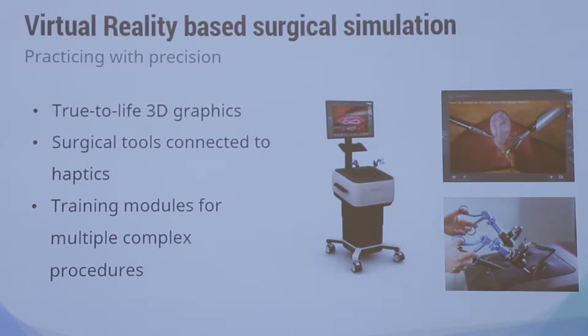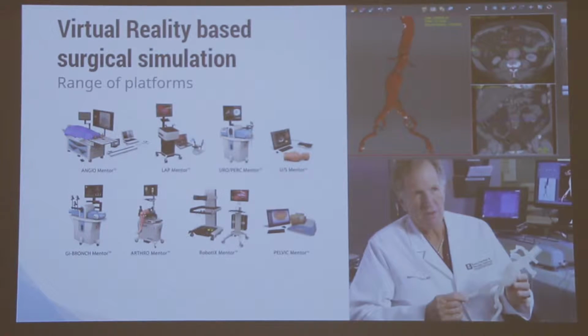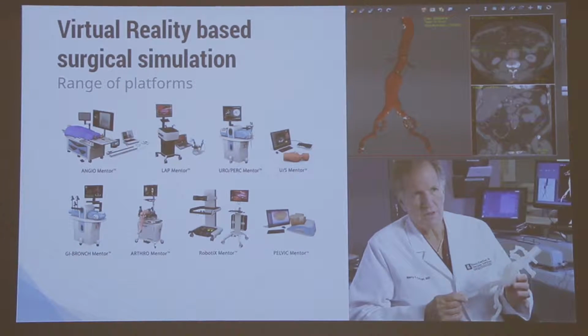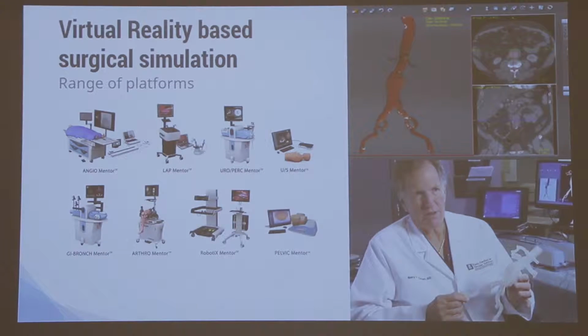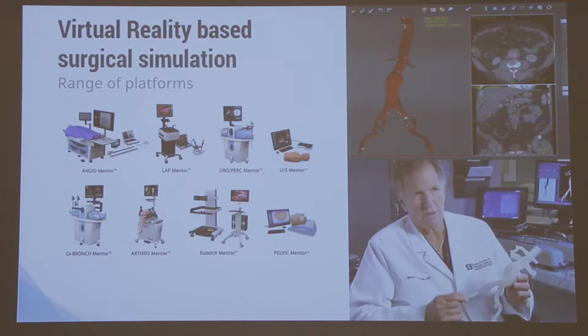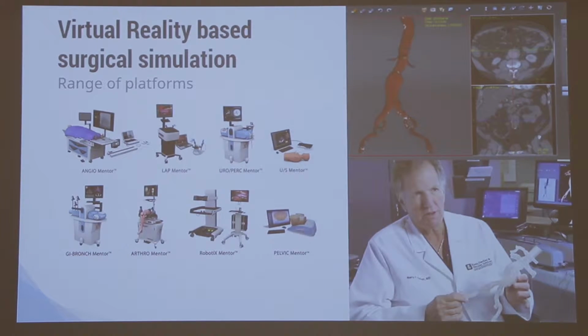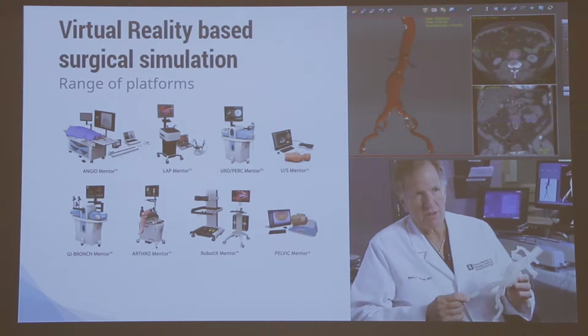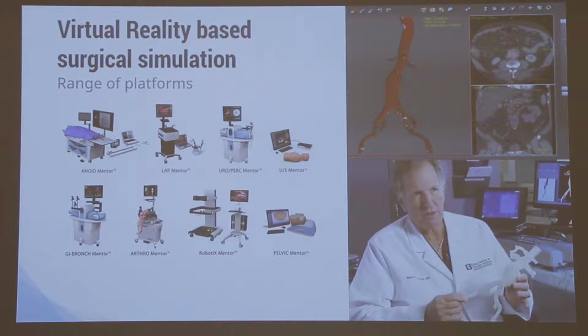And where we bring 3D printing in this story is that, depending on the kind of surgery we're aiming for, we will be able to print a 3D printed model of a patient-specific anatomy of the pathology that the surgeon is really looking into. And this is mainly interesting for not only training but also complex cases, because the surgeon will first be able to have a patient-specific model in his hands, but later on he will also be able to use these simulators, based on the medical imaging data, to go in with the actual surgical tools in a virtual environment, try the operation, and get some feeling for how that patient's pathology will feel before he actually goes into the OR and performs the operation itself.